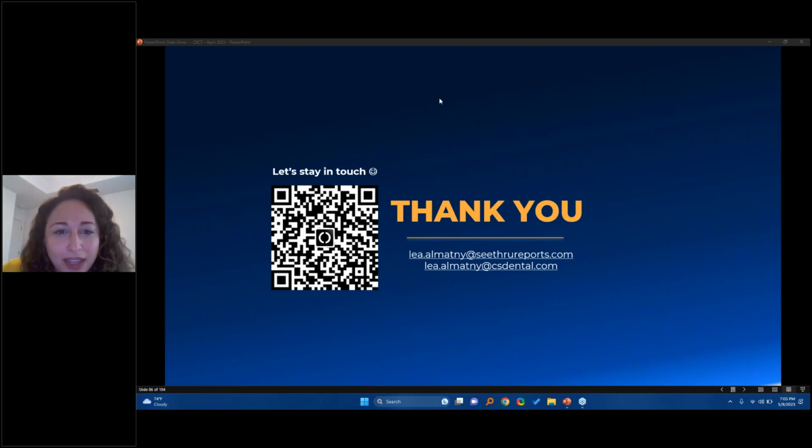On an older adult, what's a good kVp and voxel to get better quality imaging? So this would depend on what machine you're using and what voxel size options you have. I'm going to assume you have a Carestream machine because you're on a Carestream webinar.